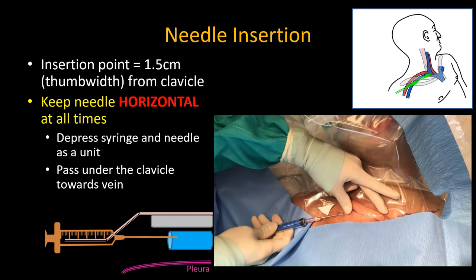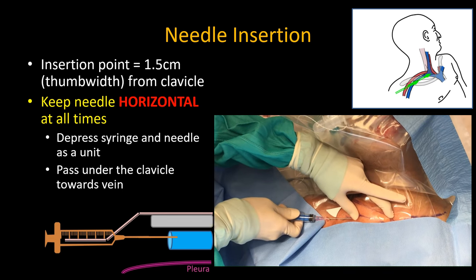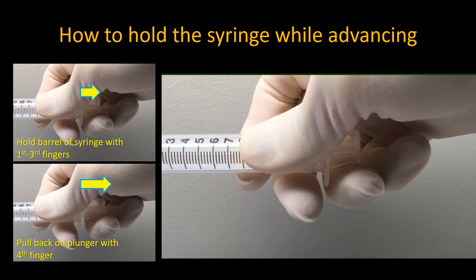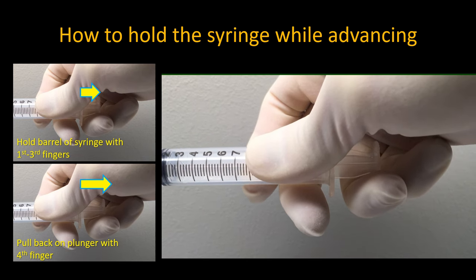The needle is inserted, the clavicle is touched to ascertain its depth, and then pressing down with the thumb on the needle tip and shaft and with the hand on the syringe, the entire unit is advanced parallel under the clavicle. Note that if you remain too close to the clavicle and feel yourself scraping along the underside of it, you may pass above the vein and miss it. It's important to be sufficiently deep. Hold the barrel of the syringe firmly with thumb, index, and middle fingers, and curl your ring finger around the flange of the plunger, pulling back on it gently and constantly.